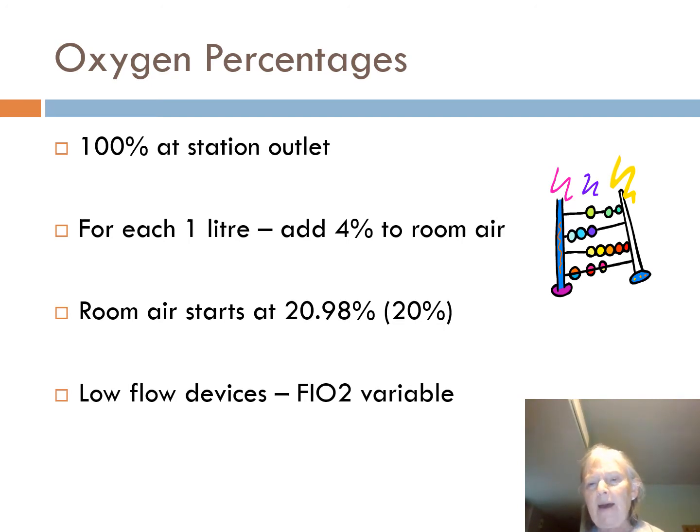What do we mean by that? Basically, what we mean is depending on your respiratory rate, anatomical reservoir, the flow set on your flow meter, and your tidal volume, that FiO2 is going to vary. We're either going to dilute it or we're going to allow it to build up a little bit higher than we really want sometimes. But whatever it is, it's not going to be something that's fixed. We do not know sometimes from breath to breath to breath how much oxygen you're actually getting.